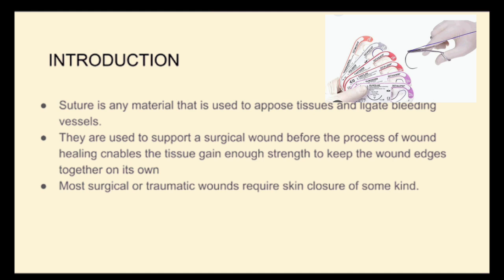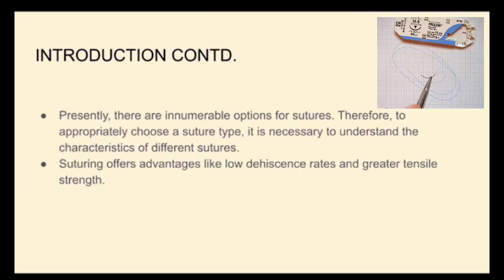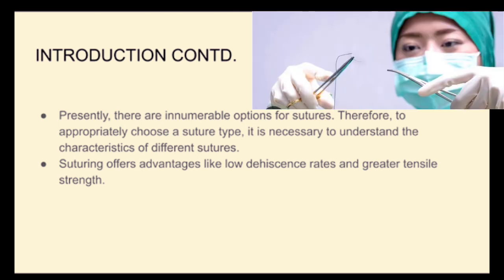Most surgical or traumatic wounds require skin closure of some kind. And presently, there are so many sutures that are used in surgery. Therefore, to appropriately choose a suture type, it's necessary to understand the characteristics of different sutures.